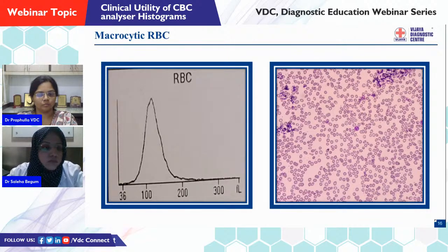This is another variation from normal. Here you can see the graph itself is starting very far from the origin, and it is taking a very broad curve and ending somewhere around 200. So this is a clear cut picture of a shift to right of an RBC histogram, meaning that the population present is mostly a larger cell population, which we can see very well here in the peripheral smear as a macrocytic anemia. So any cause of macrocytic blood picture presents with such histograms.